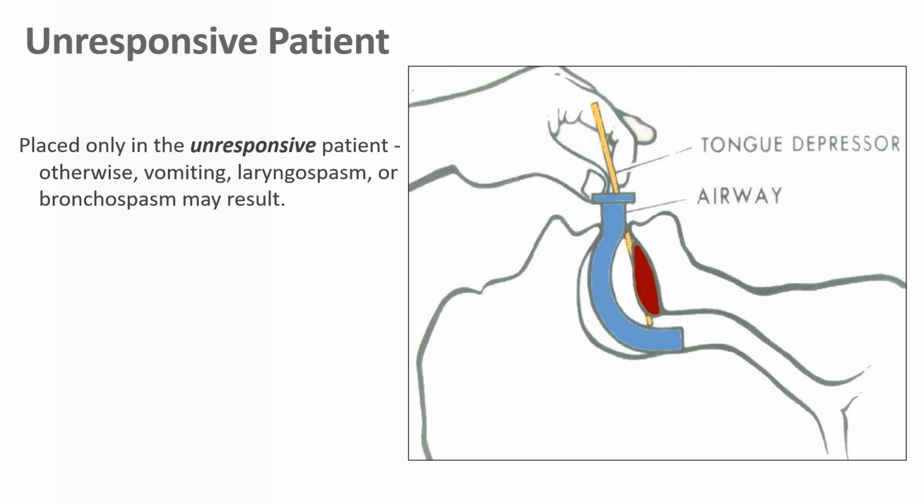A patient that's pretty well awake, because it's going to gag them. You know, stick your finger down your throat, and if you gag, that's the thing with sticking a big finger down this guy's throat.